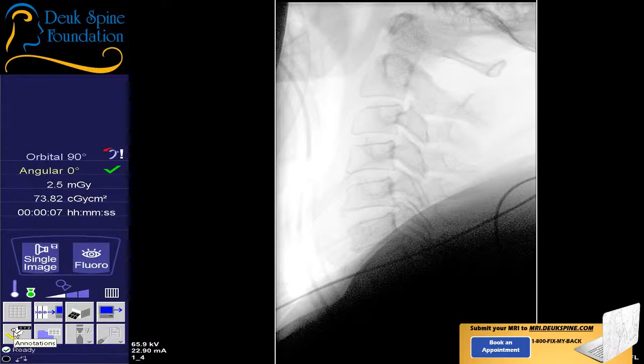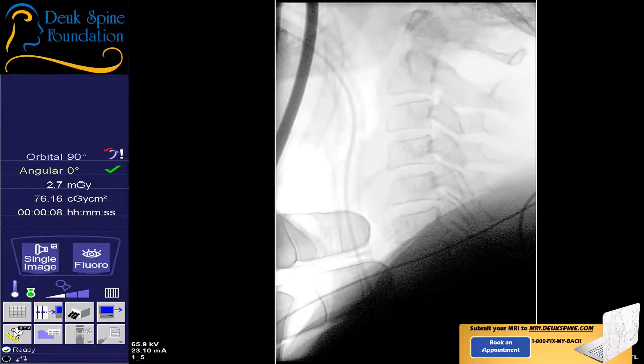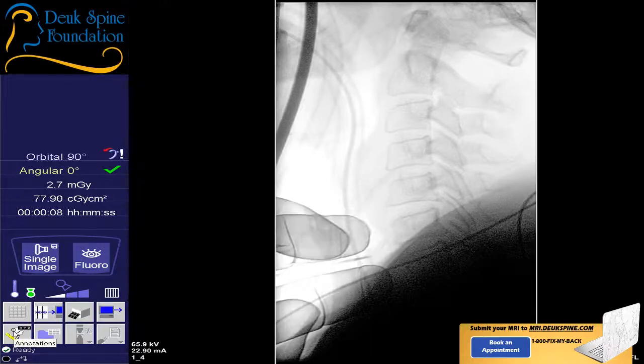So we have the patient's head and we have the front of her neck right here. And I'm going to go back and palpate the front of her spine. This is the hardest part of the surgery. Shot. So 2, 3, 4, 5, 6, 7. Once again, shot. Give me an AP. Just a quick AP right now. No, don't line everything up. Just give me a quick AP.